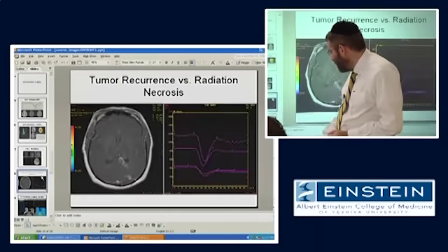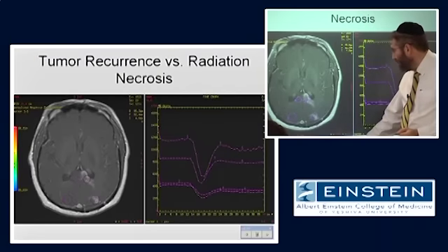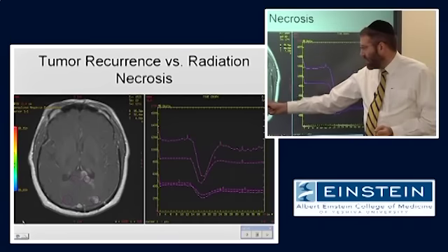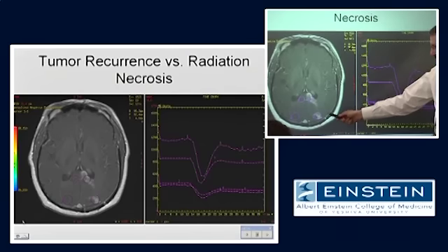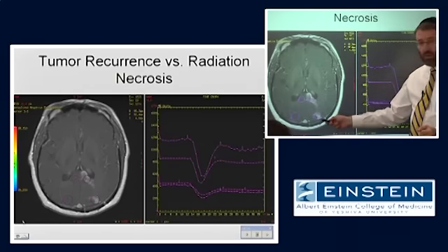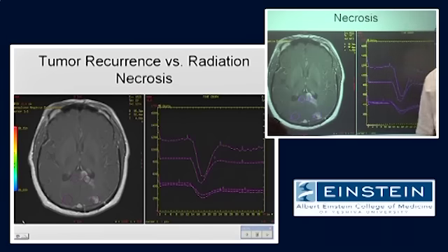You know what, let's look at one more example. This is another case, right, with contrast-enhancing abnormalities in the brain, using perfusion imaging to compare these areas of contrast enhancement to normal-appearing homologous areas in the other hemisphere.